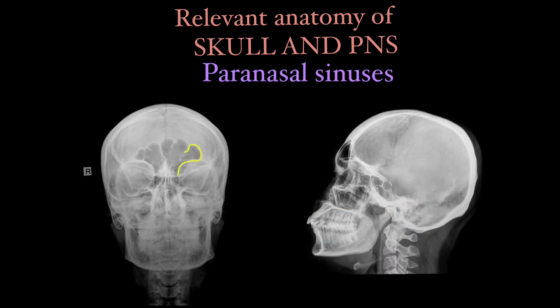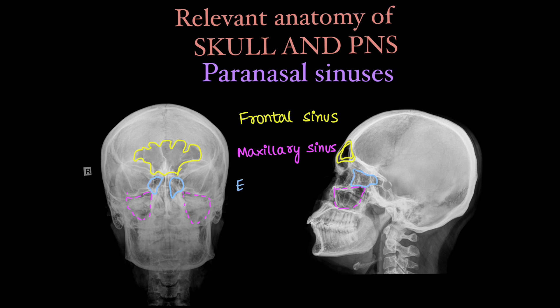Now we will look into the paranasal sinuses as seen on x-ray. Here we can see the frontal sinuses. Since they are filled with air they look darker than the bone. Here we have two paired maxillary sinuses. The one in blue is the ethmoid sinus and the one in green is the sphenoid sinus — frontal, maxillary, ethmoid and sphenoid sinus.